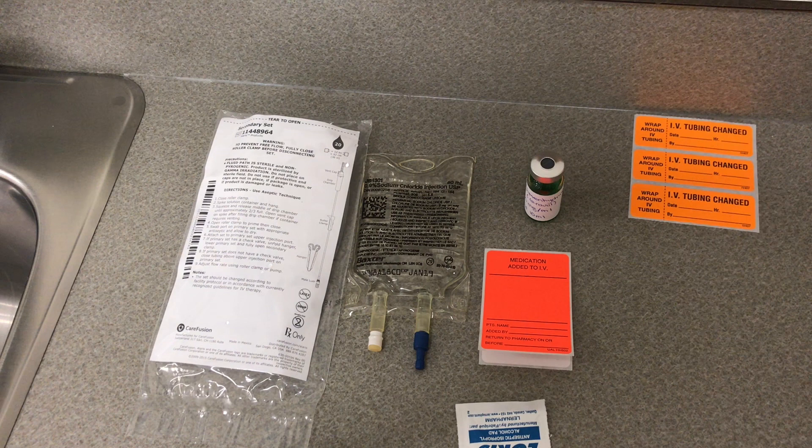Today we're preparing medication to be hung through a secondary line through intravenous therapy. We will need our secondary line, our IV solution and medication, labels for our line and our drugs, and an alcohol swab.